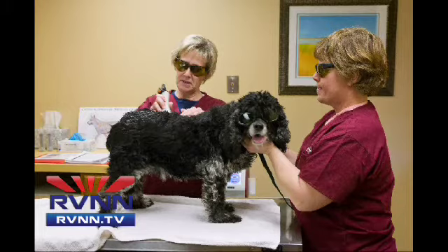But basically, what you'll see is it looks almost like a little wand, and it's attached onto a big long fiber optic cord. And you have to go over the area that you're treating and the surrounding tissues. It's sort of the same pattern as if you were using a spray painter. So you go back and forth nice and slowly over the area, in as many directions as you can and from as many angles into the joint. So let's say if you were going to do an ankle, you wouldn't just do the outside, you would do all the way around. So you can hit all the cells from as many directions as possible.